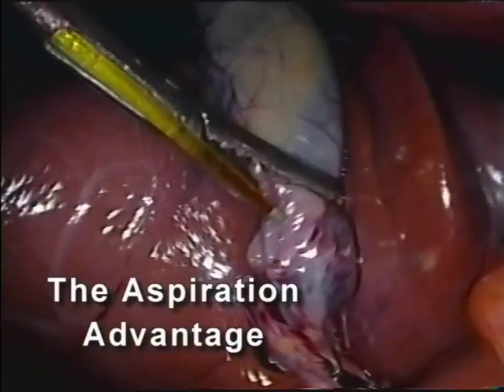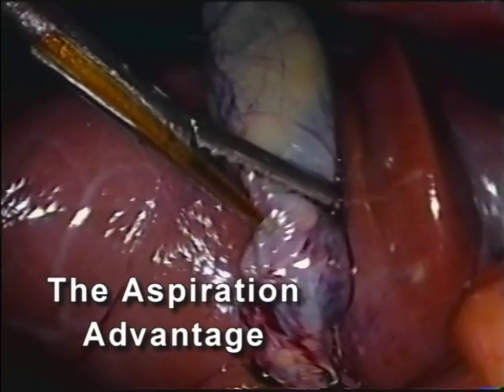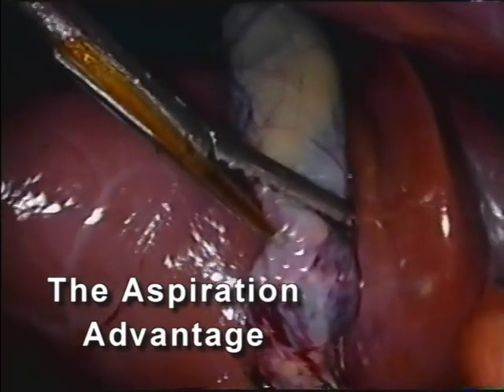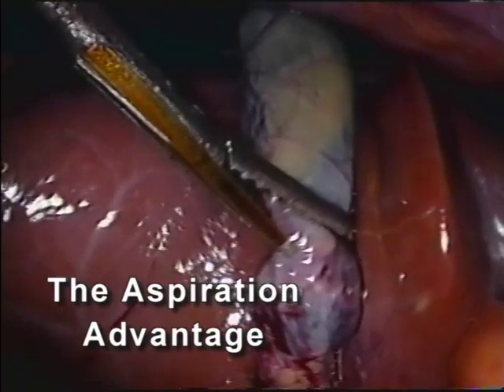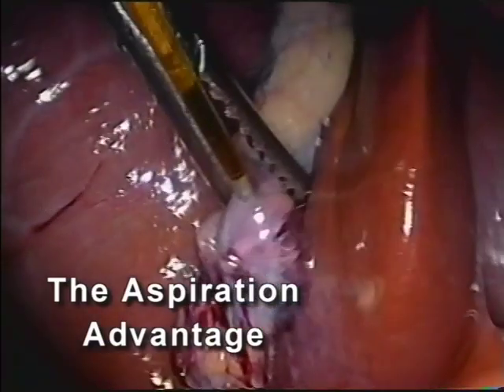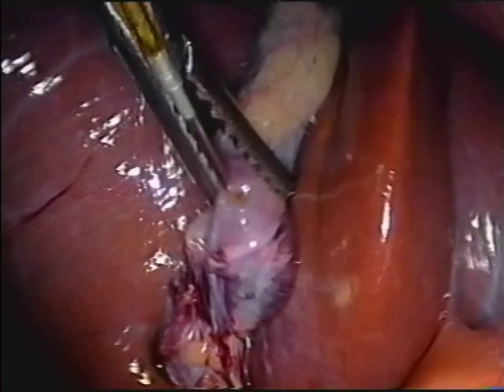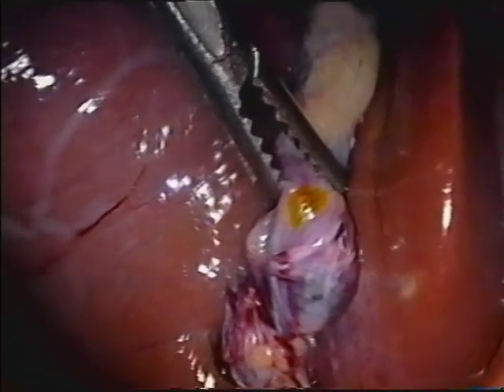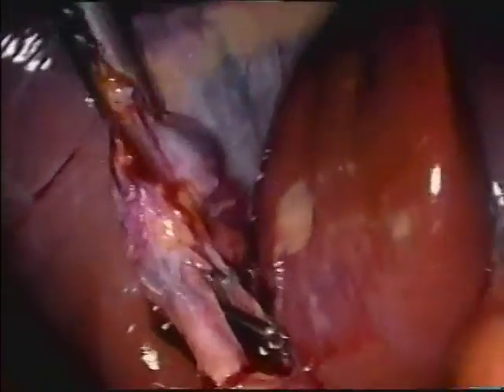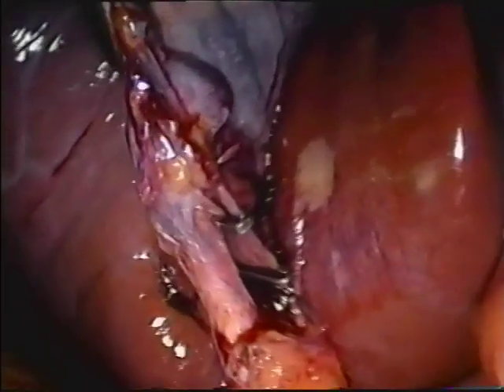After cholangiography has been completed, the clamp jaws are opened and the gallbladder is easily aspirated through the 19-gauge needle, which is lying in a dependent portion of the gallbladder. The needle and catheter are then withdrawn. Bile leakage from the needle puncture site is minimal. After the catheter has been withdrawn, the channel valve can be closed or left open as a smoke vent.